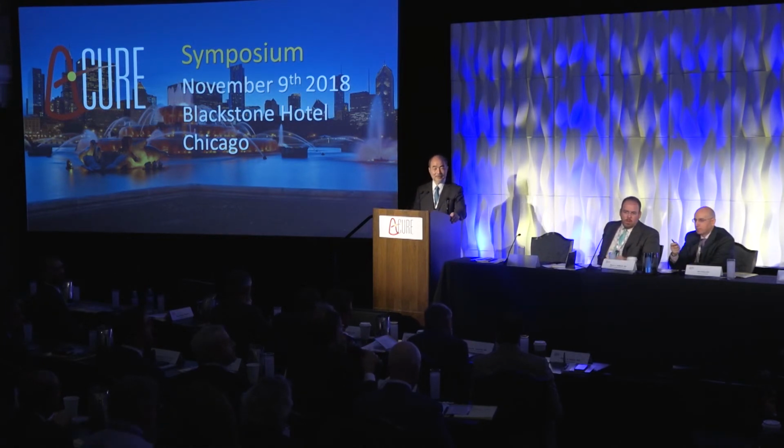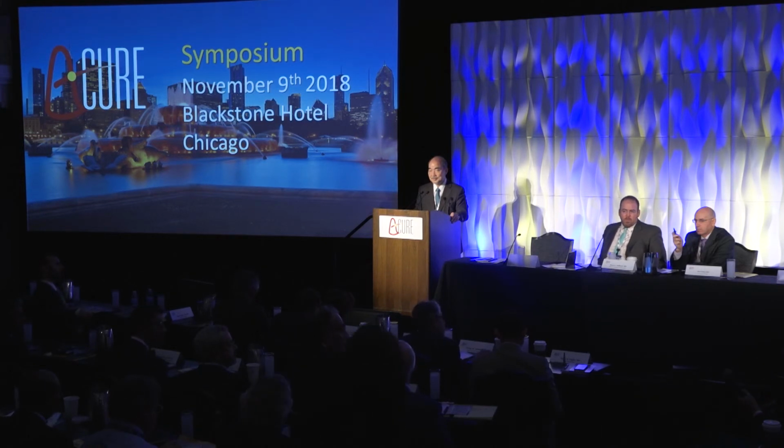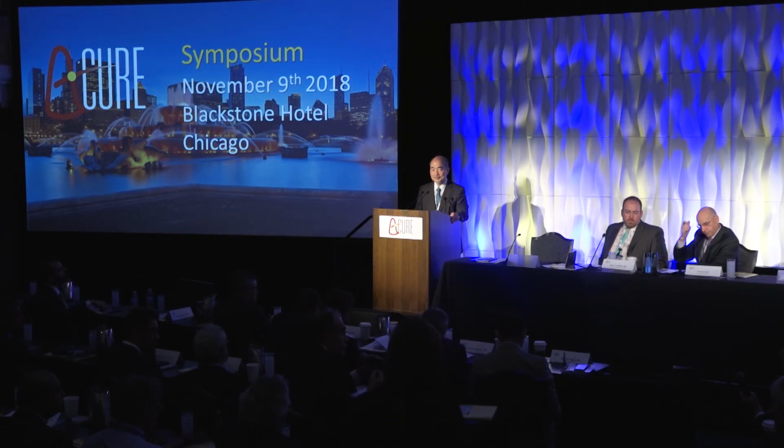Okay. Yes, I congratulate you on this work. I believe it's very important because, responding to this question, if you just run the pump at the highest level without running into suction, clinically this is really challenging because conditions are changing all the time. If you're running near the full level, you get suction alarms with the CP, for example, very quickly, which decreases acceptance by the personnel. So having a system that finds the optimal work point, also from the clinical side, is a huge progress in my view.